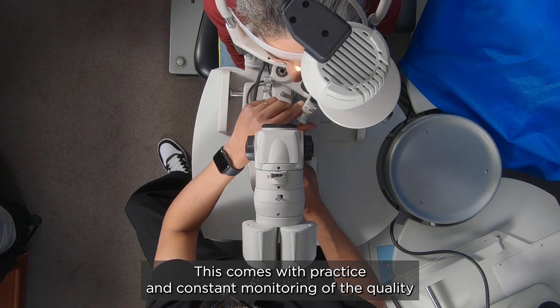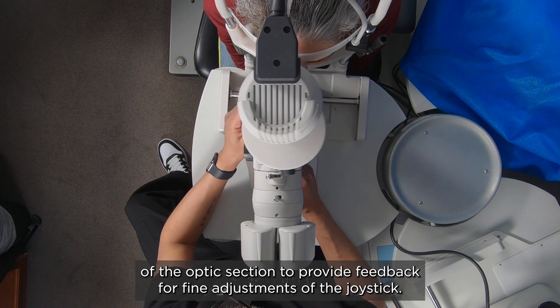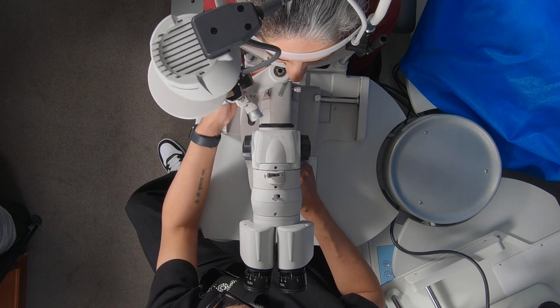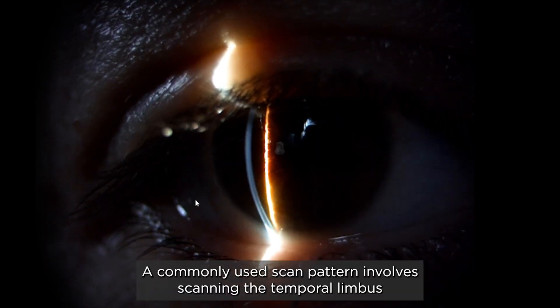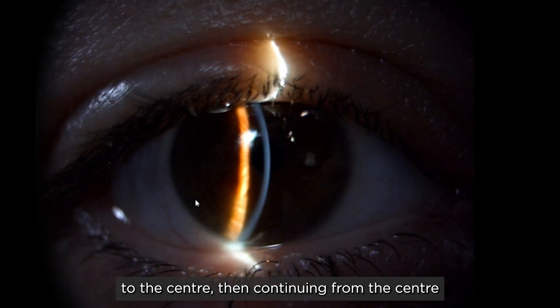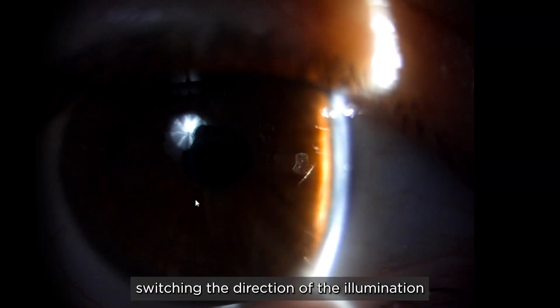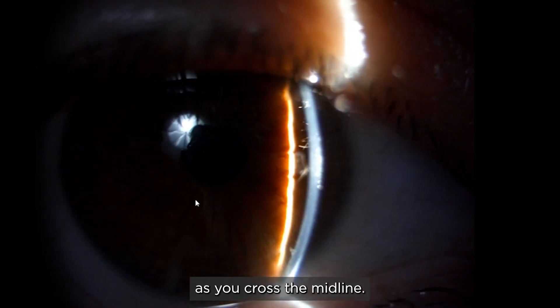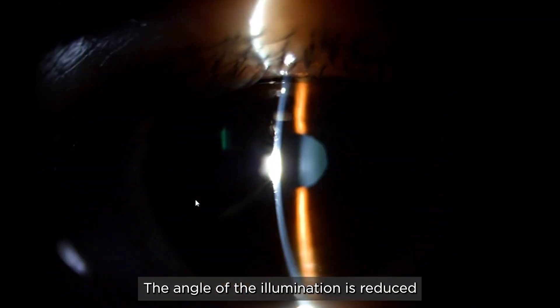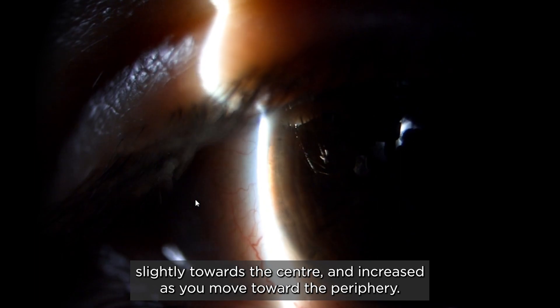This comes with practice and constant monitoring of the quality of the optic section to provide feedback for fine adjustments of the joystick. A commonly used scan pattern involves scanning from the temporal limbus to the center, then continuing from the center to the nasal limbus, switching the direction of the illumination as you cross the midline. The angle of the illumination is reduced slightly towards the center and increased as you move towards the periphery.